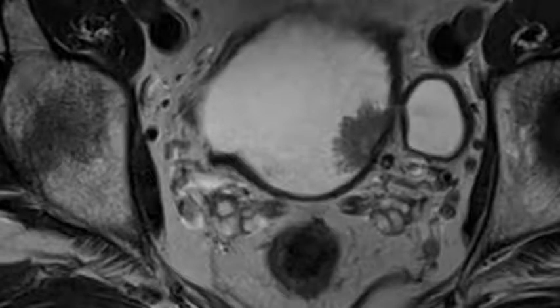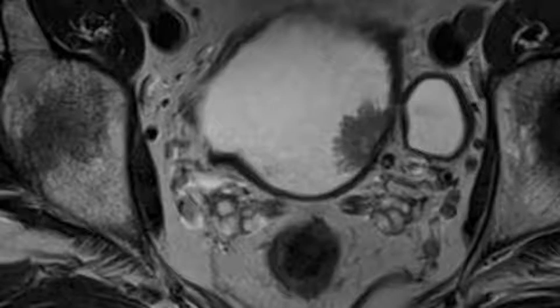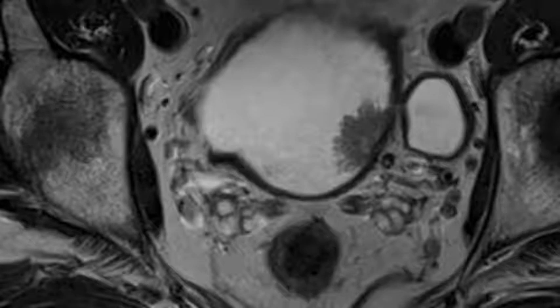Axial spin echo T1 weighted images with a large field of view are used for evaluating the perivesical fat planes for extravesical tumor infiltration, pelvic lymphadenopathy, and bone metastasis. The urine in the bladder has low signal intensity on T1 weighted image, whereas the bladder wall has intermediate signal intensity and the adjacent fat has high signal intensity. On T2 weighted image, the urine has high signal intensity and the bladder wall has low signal intensity.